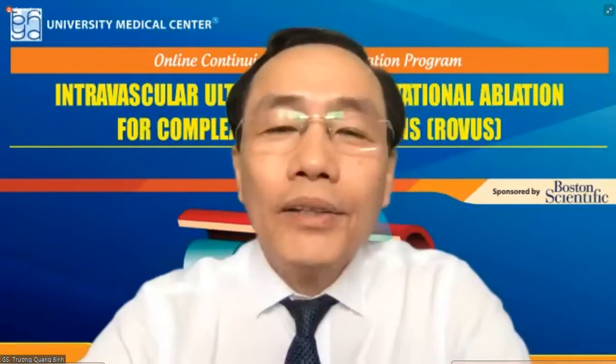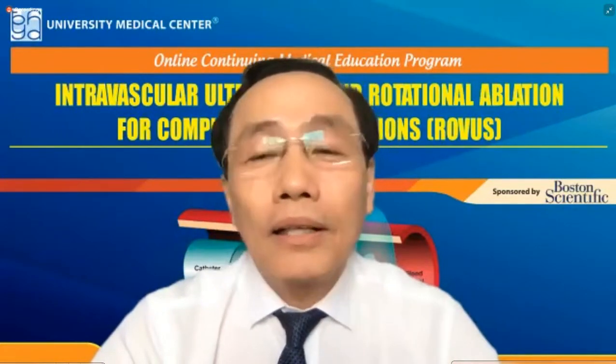Dr. Phương, you have three questions. The first question, why didn't you use IABP for your case? The second question, why didn't you use IVUS before we put the stent, before we do the procedure for the left main?